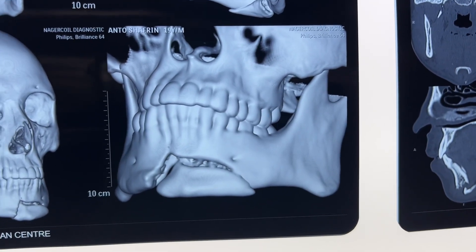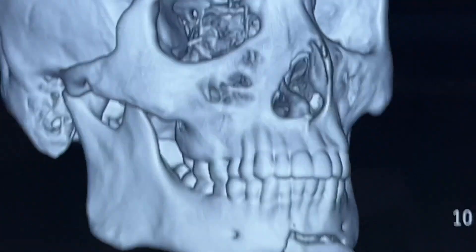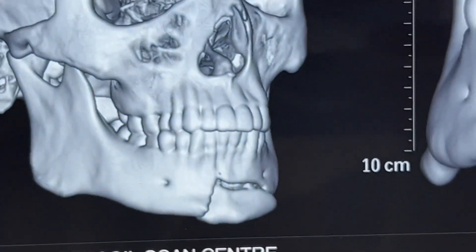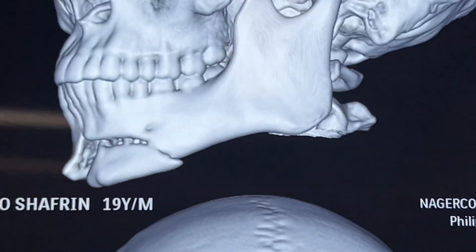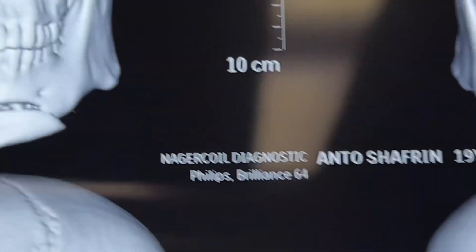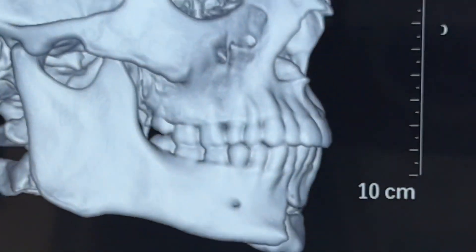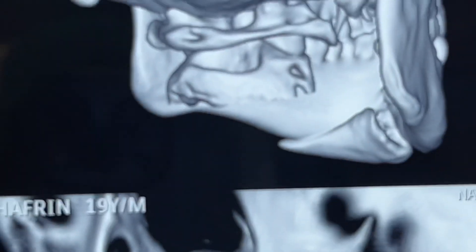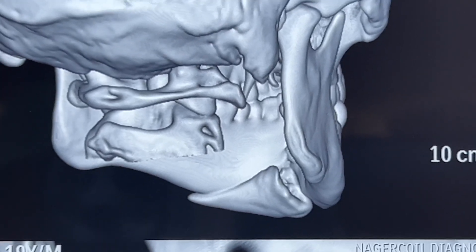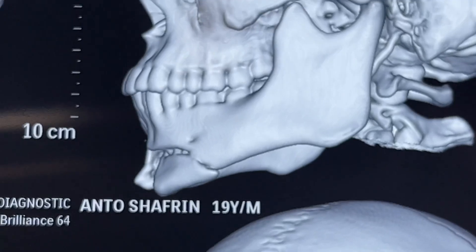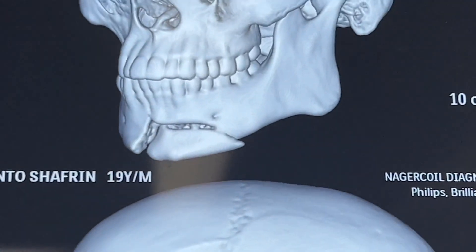This patient sustained a road traffic accident, and you can see the trauma causing the fracture on the lower jaw. This segment of the chin between the mental nerve has been displaced inferiorly and posteriorly. We're going to do surgery to bring this back and fix it correctly, because the muscles attached onto the geniohyoid displace the segment, causing this type of unfavorable fracture.